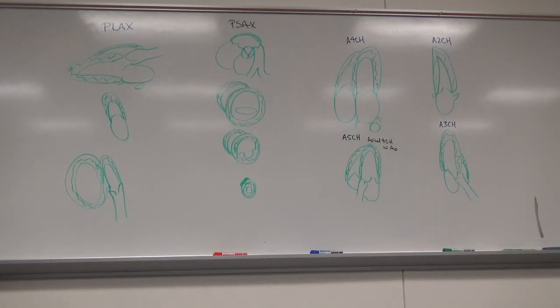Okay. So that might be partly why, but it would surprise me that they wouldn't have it in there. There is a long axis, but it just wasn't how they presented the other views. Okay. It wasn't as prominent, I guess.